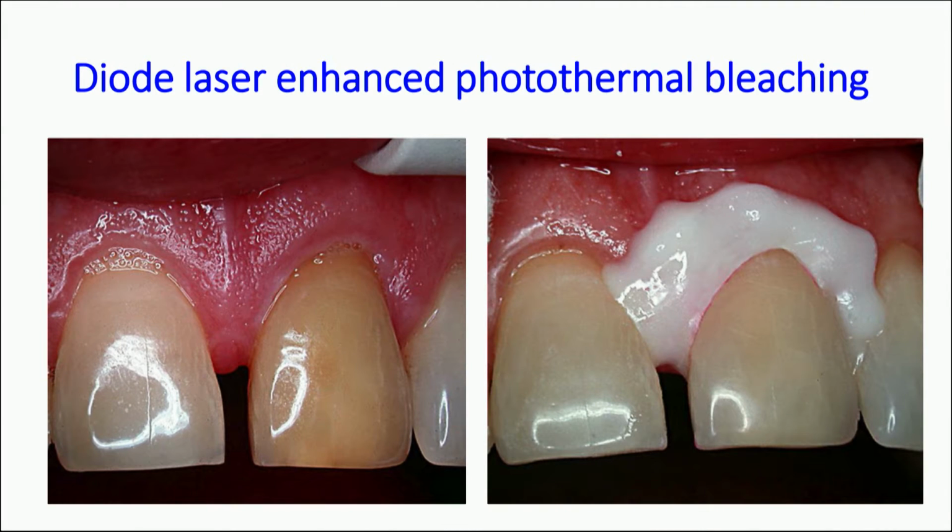Excellent questions, thank you. I wanted to talk just for a few seconds about controlled heat for bleaching. The breakdown of hydrogen peroxide, of course, is very much dependent on temperature. That's why we keep peroxide solutions in the dark and also in the fridge.